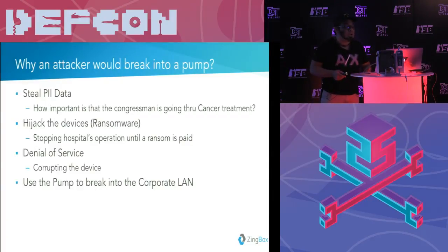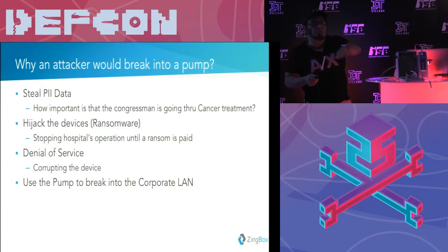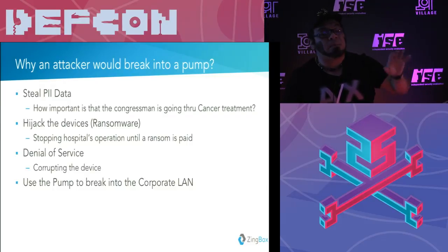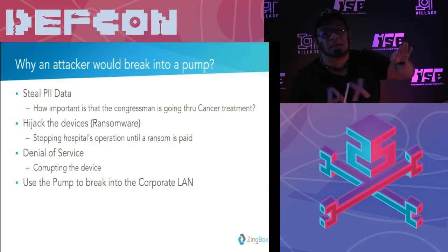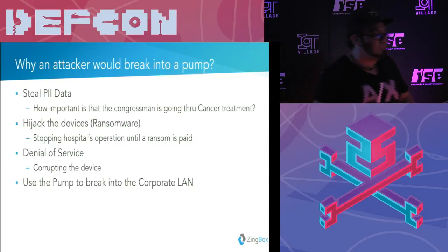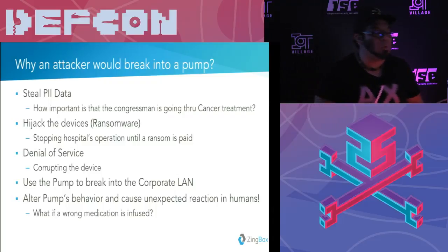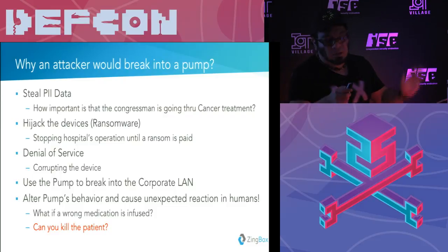And of course, you can also use the pump to break into the LAN. This can be a breach to get into the network and from there to the whole set of devices. Not only medical devices, it can be anything connected to the access point. Keep in mind that this device connects to an access point, so if you are able to break into the access point through this device, you can get access to the network also. And obviously the most important thing here is the human. If you find a way to alter the behavior, then you can be infusing liquid that can harm a human, which is something that we don't want to know. I'm not a doctor, but probably you can kill them, I don't know, probably.